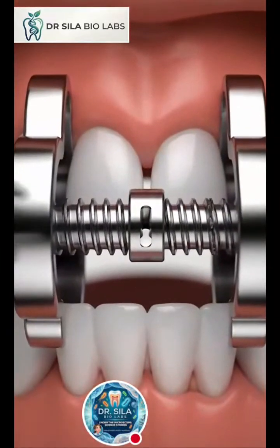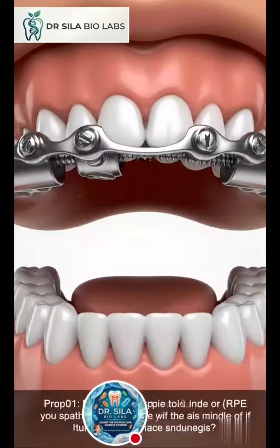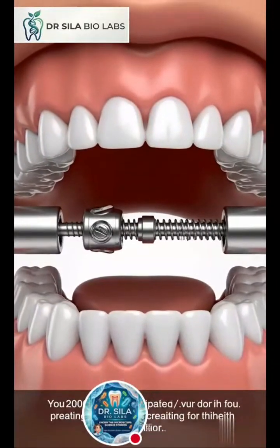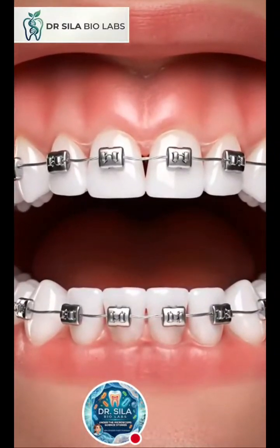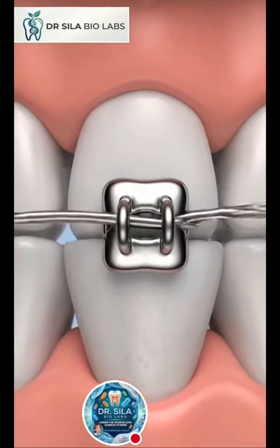Expanding the palate. A rapid palatal expander device is fitted to the upper molars. Over time, the expander gently pushes outward, widening the upper jawbone to create much-needed physical space for the teeth to move. Bringing hidden teeth forward. Once the jaw has widened, orthodontic brackets are glued onto the front surfaces of the teeth. A flexible metal arch wire is threaded through them.